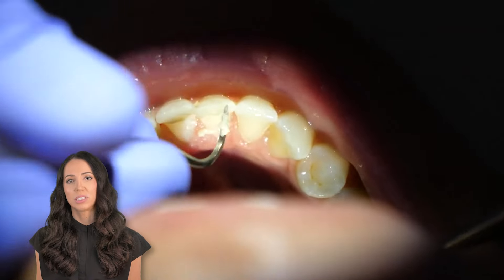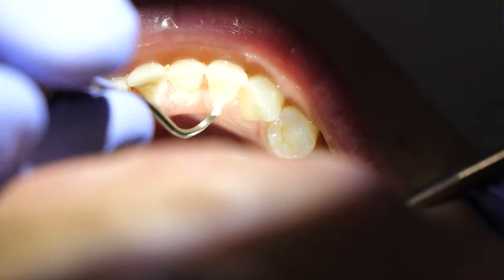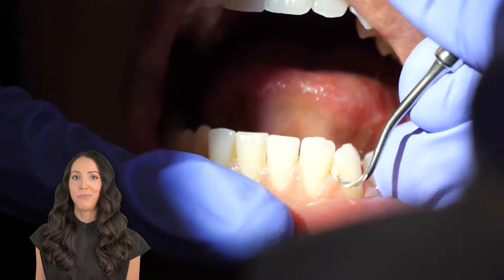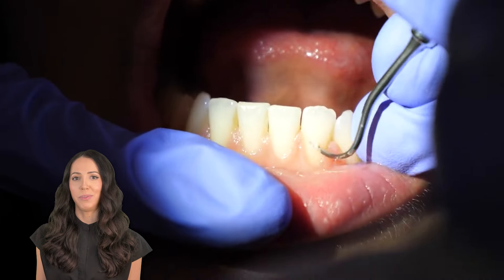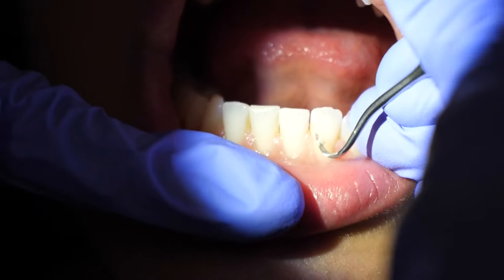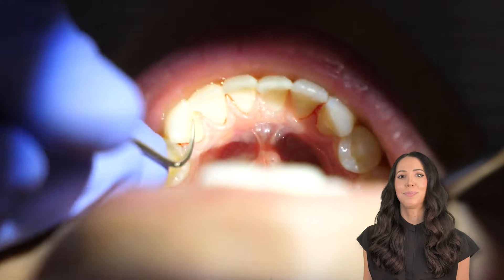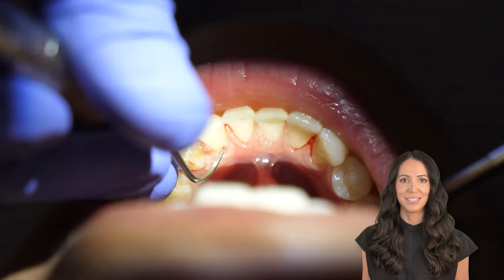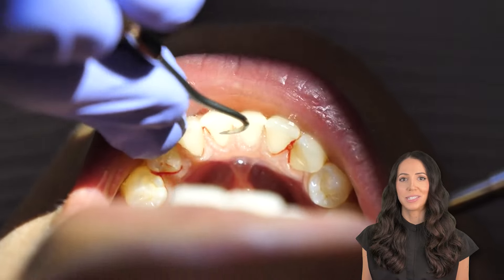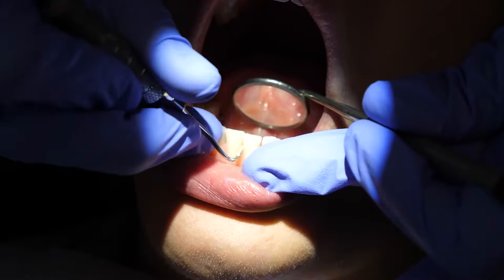Now let's clean the surfaces toward me. I finished everything away from me, so now we'll watch and listen to the beautiful ASMR of scaling the surfaces toward me. Here you can see I was just cleaning the direct lingual — it helps me to stay focused on cleaning the surfaces toward me, while of course coming around from the lingual and taking care of those areas as well.